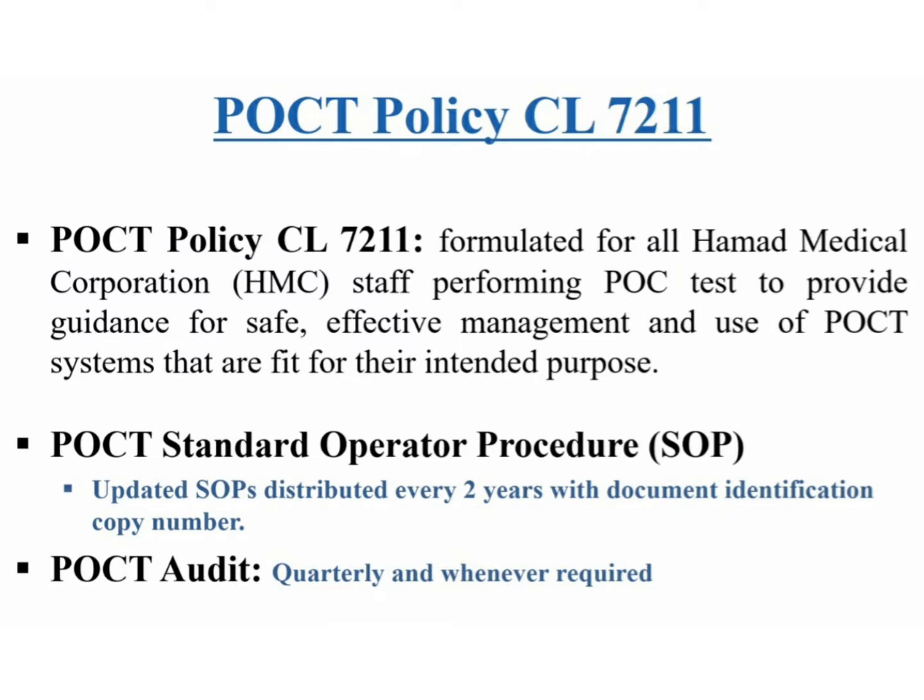POCT, or point of care testing, are tests designed to be performed outside the physical facilities of the clinical laboratories. This is performed by competent, certified, and authorized non-laboratory personnel. POCT policy is under CL 7211.